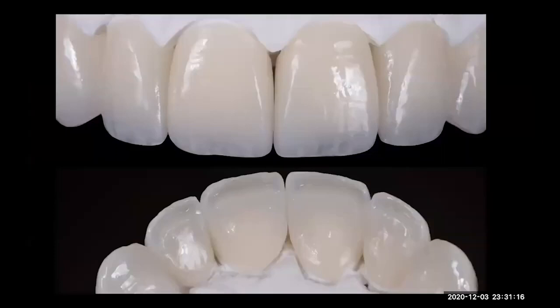And then when you press, the material is really easy to organize and follow, and you get a good copy of the anatomy and everything. It's really, really nice. So you can see the translucency. It's really important that you calibrate your wax before you press, because it's dangerous to go in with any instrument to calibrate later, since the Emax material is really hard at that stage. So calibrate the wax before you press.